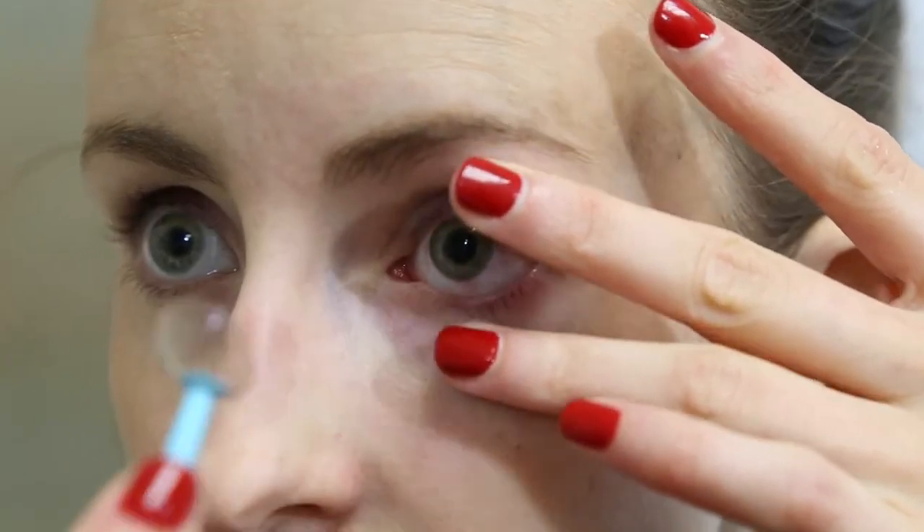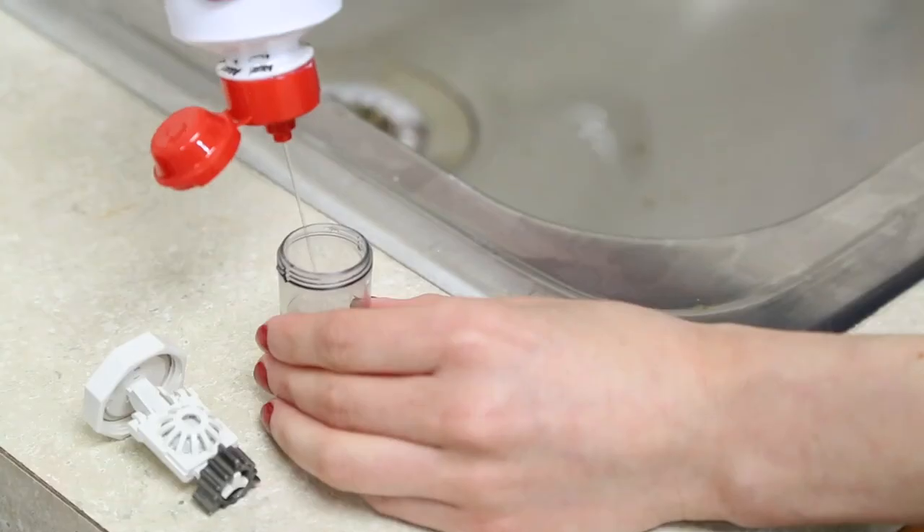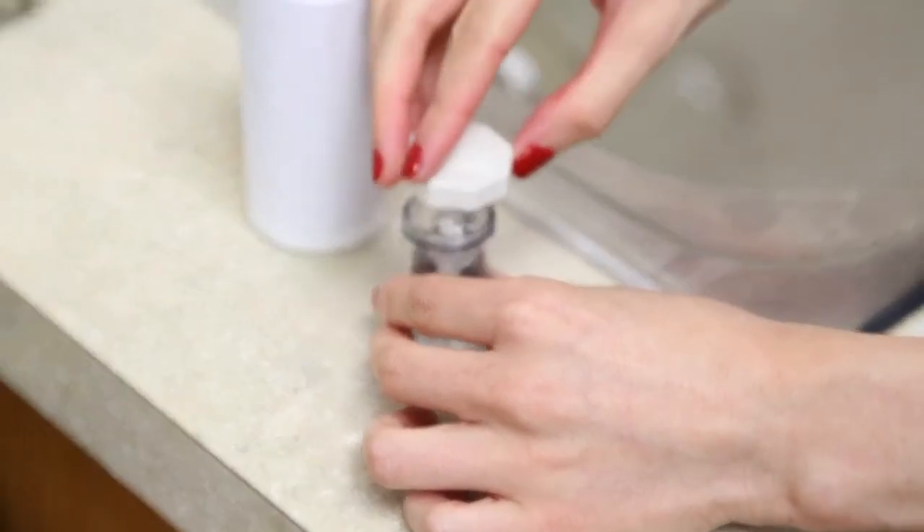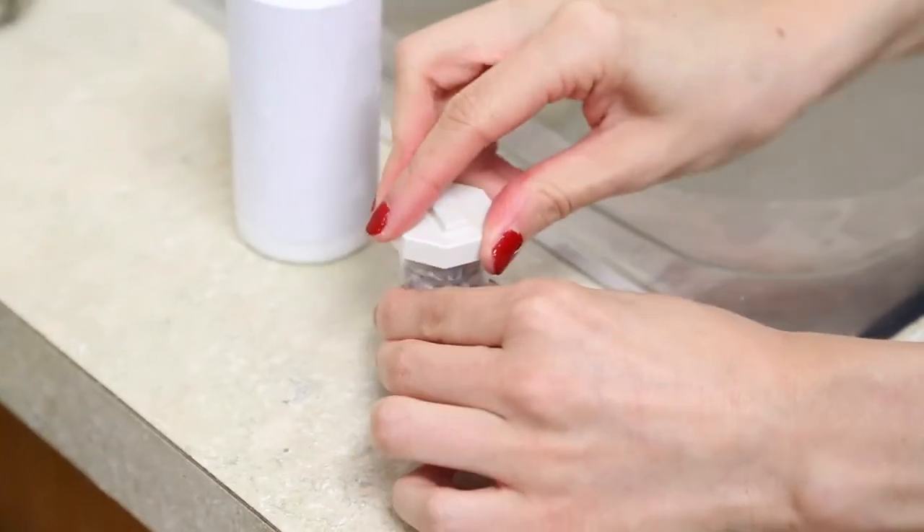Make sure not to place the small plunger in the very center of the lens as this will create too much suction. Once the lens is removed from the eye, it is important to make sure that you clean it before placing it back in the case.